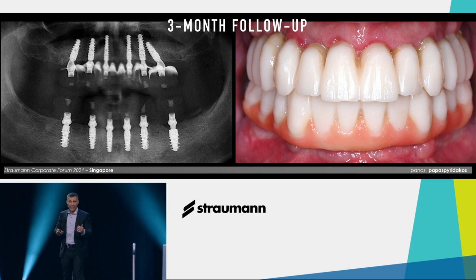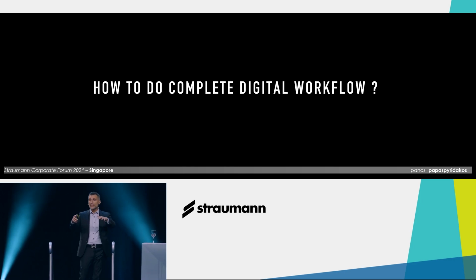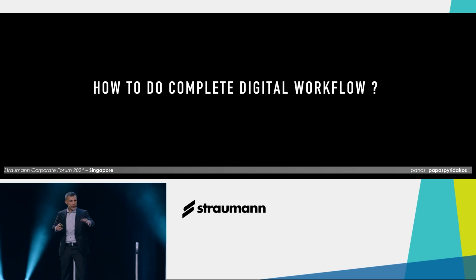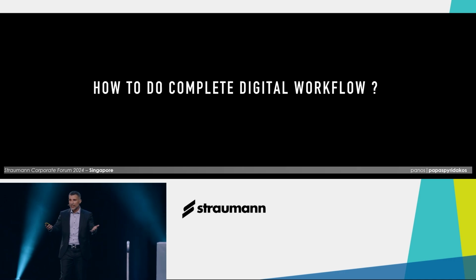But how do we do it digitally? How do we implement a digital workflow? We do the same thing. We will take 2 scans. A scan of the teeth, of the provisional, and a scan of the implants with the scan bodies.